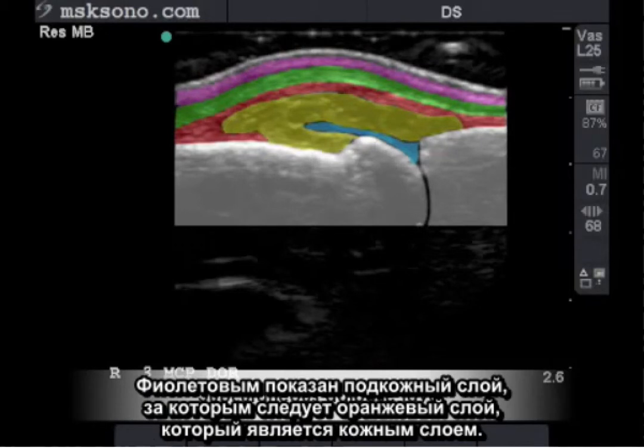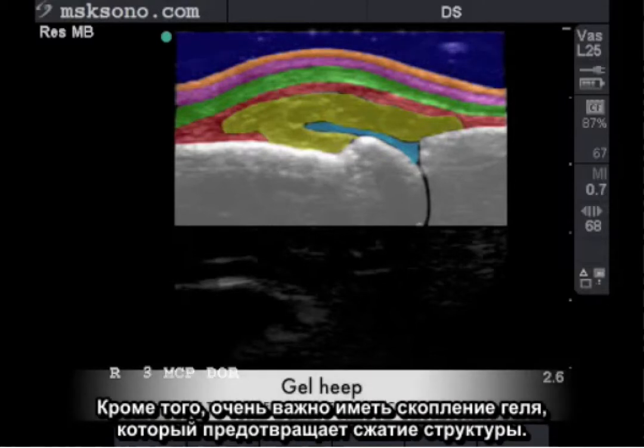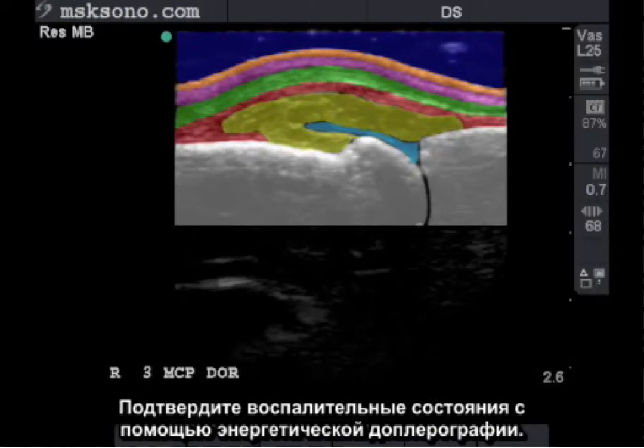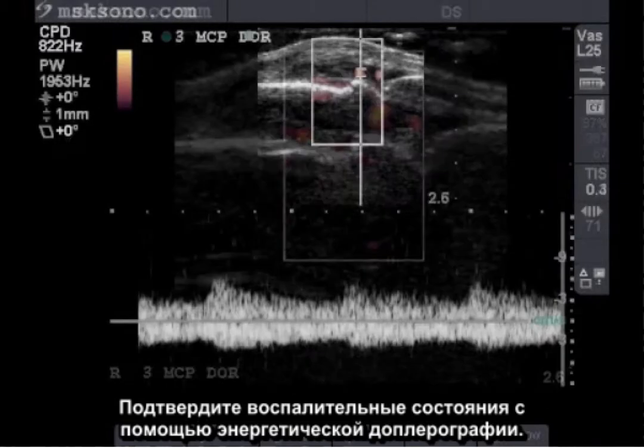In purple is the subcutaneous layer, followed by the orange layer which is the cutaneous layer. Also, the very important gel heap is keeping these structures from being compressed. Confirm inflammatory conditions with power Doppler.